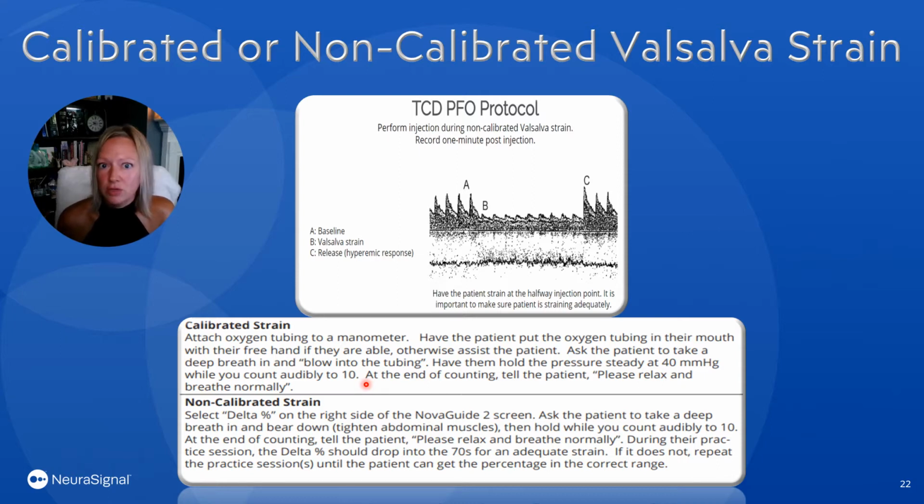If you do not use a calibrated strain, you can watch that mean velocity. As we said, it will be decreased during Valsalva, and then the mean velocity will increase once that Valsalva is released to know that a proper Valsalva was performed.